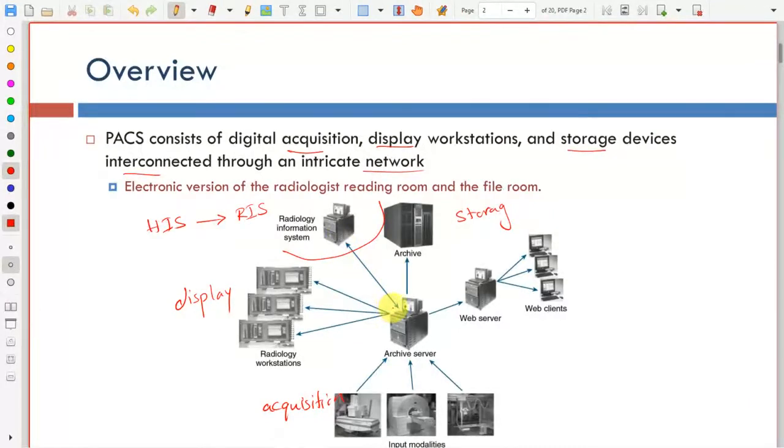important. So for example, if the physician who saw the patient asked the patient to go and do an ultrasound imaging, he must enter a request through the HIS that this patient has to do this kind of examination. This request goes to the RIS, and the scheduling of the patient goes through the RIS, and this is sent to the archive server so that when you acquire the data, you can link that request to the acquired data and save them in the archive.